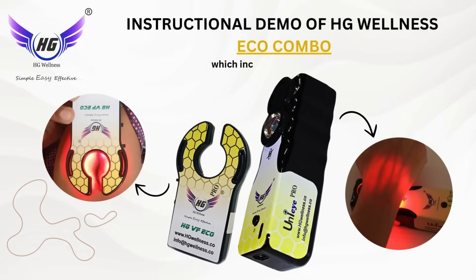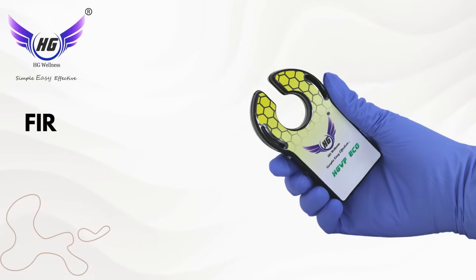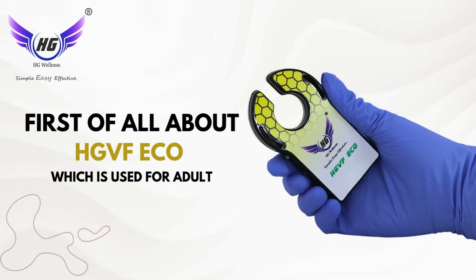Instructional demo of HG Wellness ECO Combo, which includes ECO Plus and Uni-Eye Pro. First, about the HG VF ECO, which is used for adults.